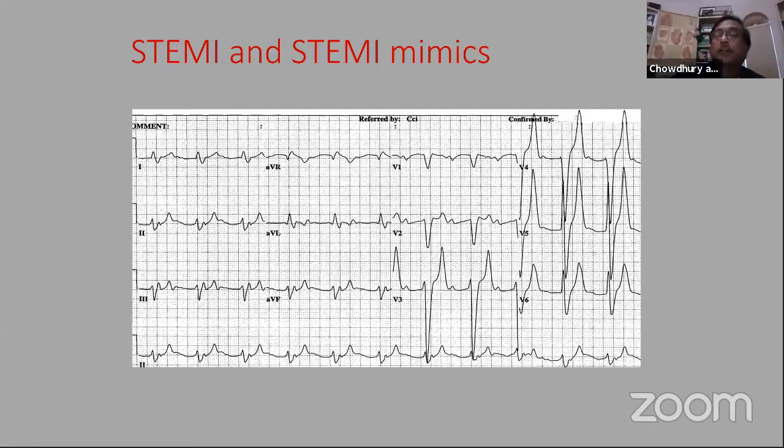The patient is 50 years old with chest pain, but the patient is on dialysis, missed dialysis, has lethargy and is coming in with this. So the emergency room physician is panicked. They'll call you for a STEMI and you look a little carefully at the EKG. You need to recognize that there are features of hyperkalemia. And if you fail to recognize it and rush to the cath lab, you may have a disaster.